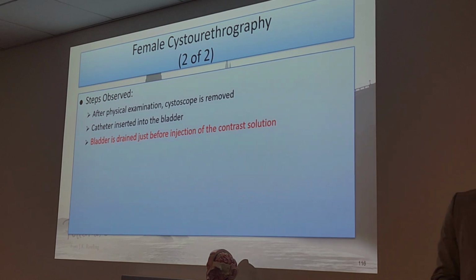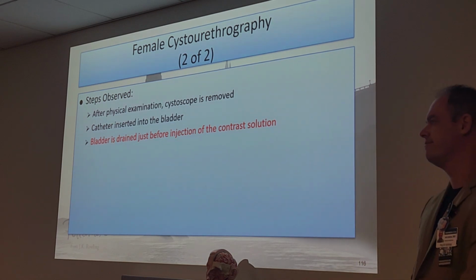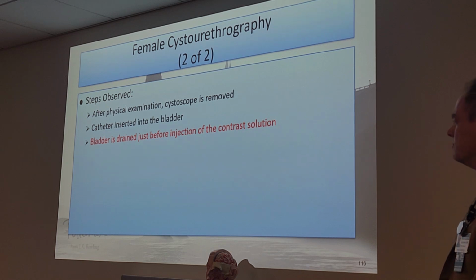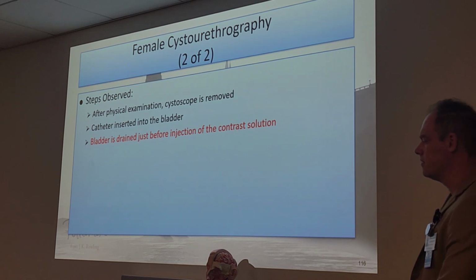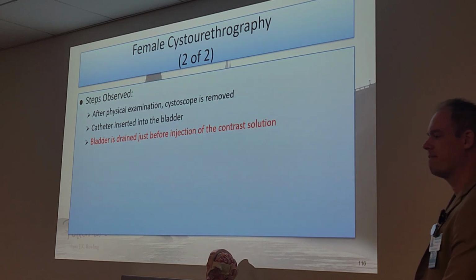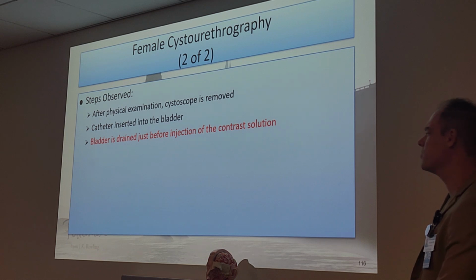Just make sure that the doctor's putting everything in the right spot. I've seen doctors screw that up too on female patients. They're not as smart as they think they are. Sorry. Usually you'll be the one doing the catheterization for these beforehand, depending on where you work.